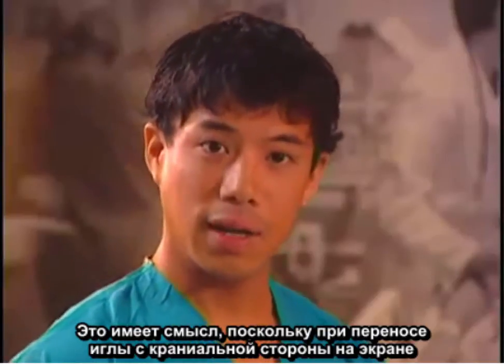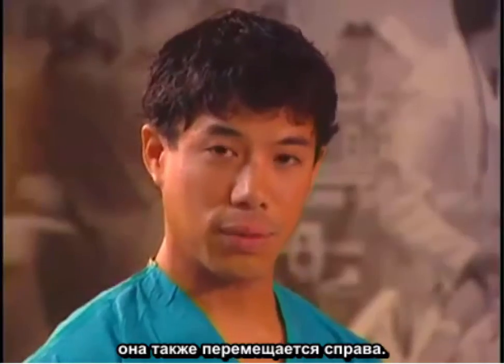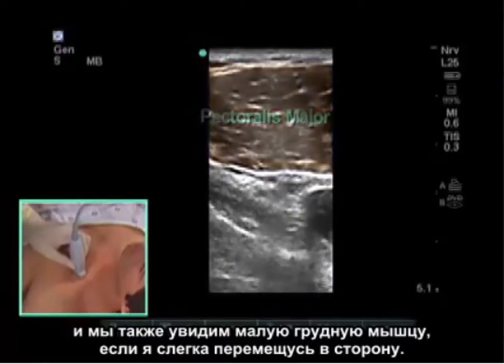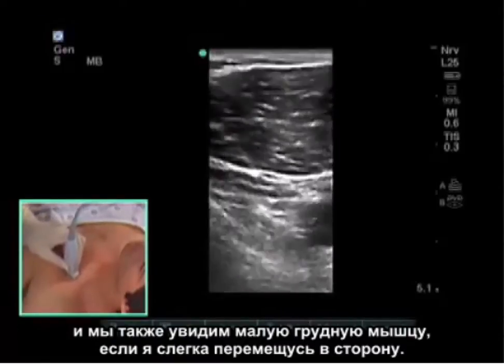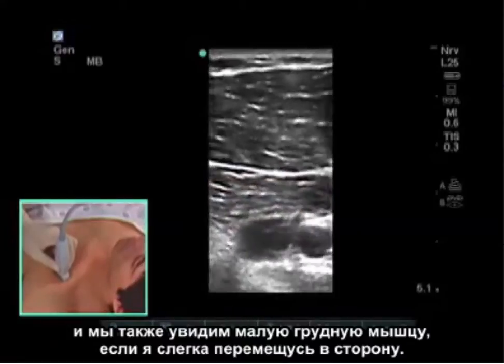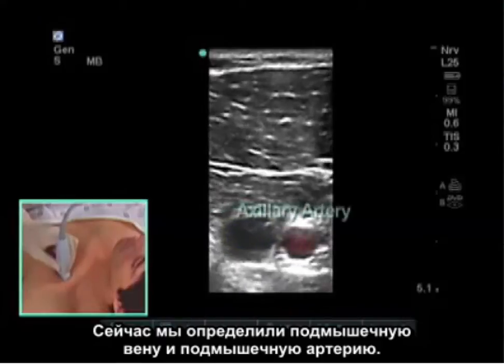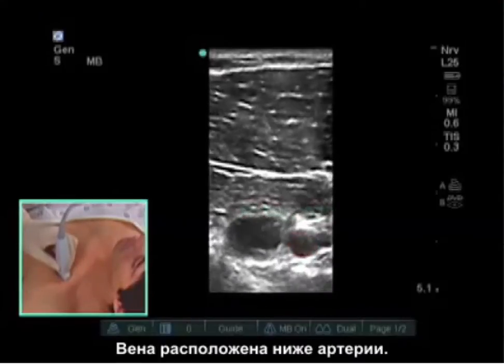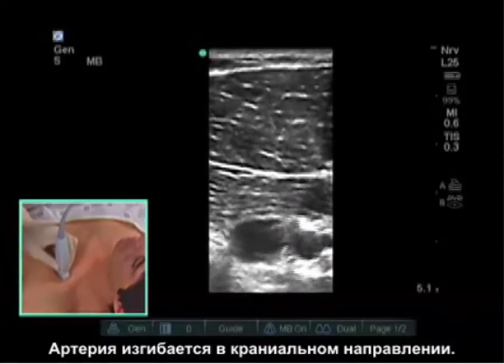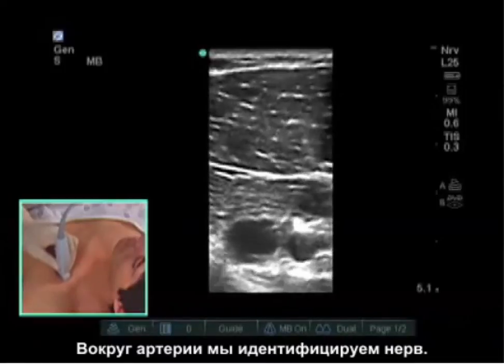This makes sense because if I bring the needle from the cranial side on the screen, it will also come from the right side. The first thing we see here is the pectoralis major, and we will also see a pectoralis minor if I move slightly lateral. Here we have now identified both the axillary vein and the axillary artery. The vein is found more caudal than the artery; the artery is found cranial.